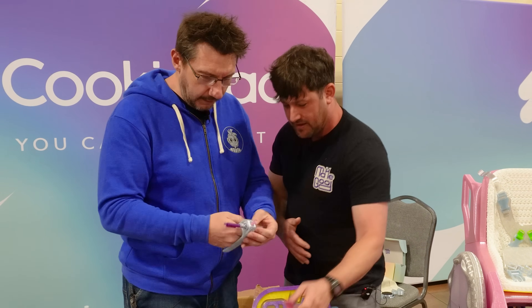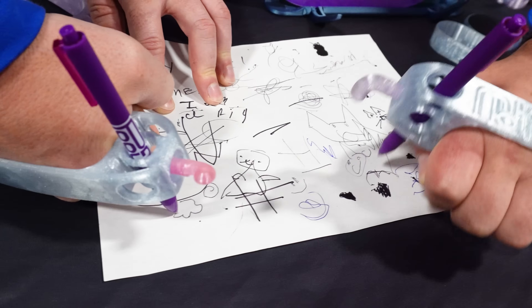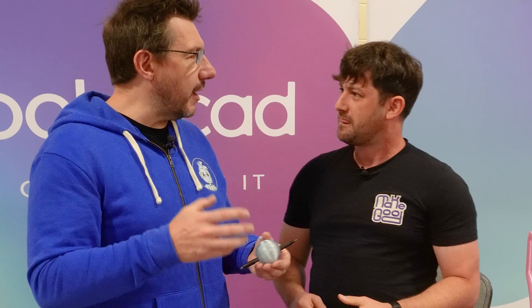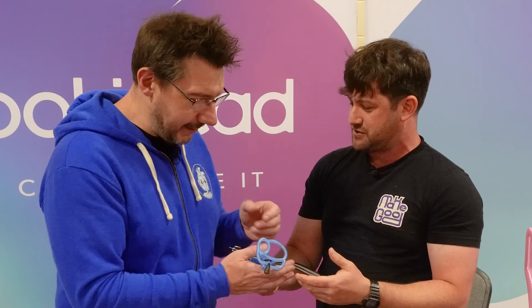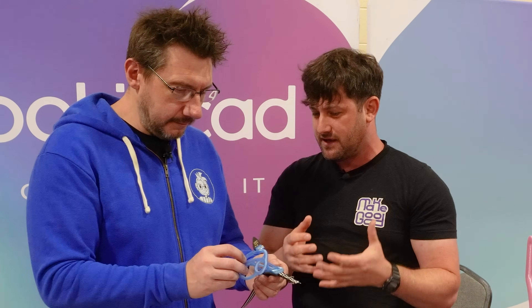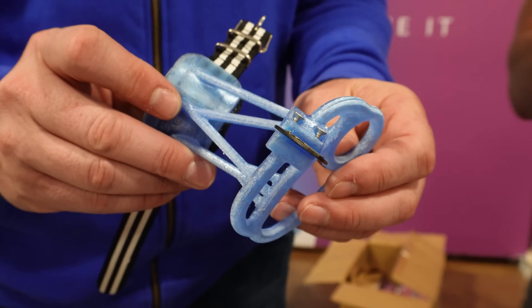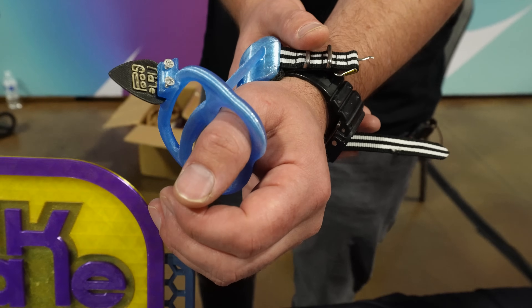So that is what we call a palm pen holder — it goes around your palm, and you can set it up so you can have the pen going this way or going down. Just an easy, accessible way to write. We do a lot of adaptive writing devices, a lot of adaptive grip devices. This is a pen ball. Adaptive writing, adaptive gripping — for people that don't have full dexterity with their hands — to be able to carry a bag of groceries, open a door, hold a toothbrush, play guitar. What it's really about is working with somebody's abilities where they're at and then working backwards to where they want to be. This literally was a kid who had an injury, couldn't hold a guitar pick anymore — he played in a family band. We quite literally took his hand, put the guitar pick where it needed to be, modeled backwards to his wrist, and that's how we came up with this. And what helped that one kid, we've now sent these to people all over the country with similar issues.